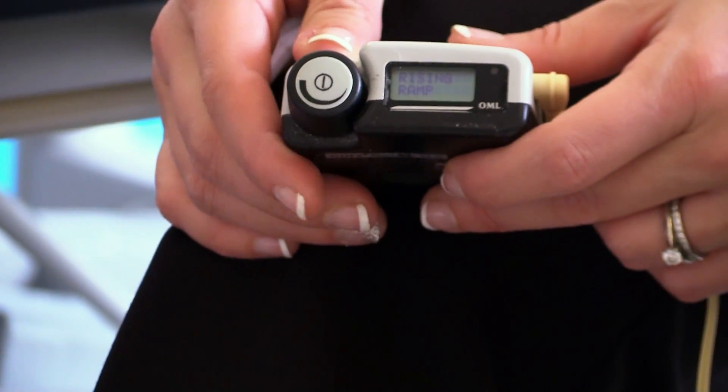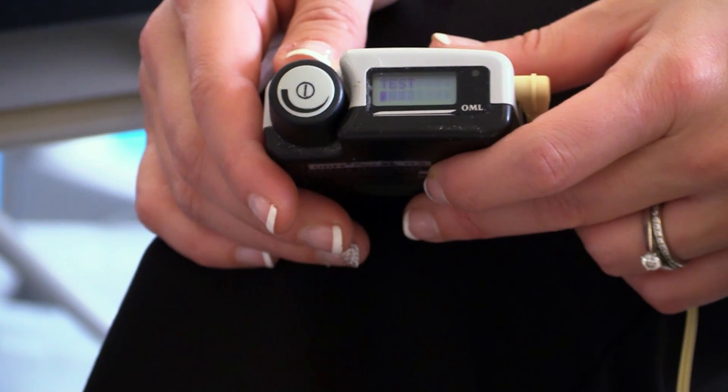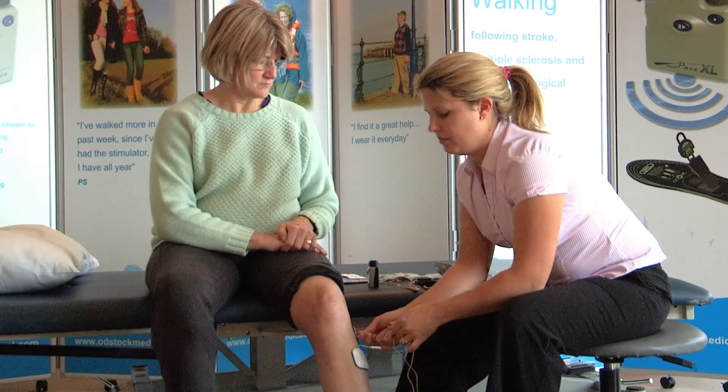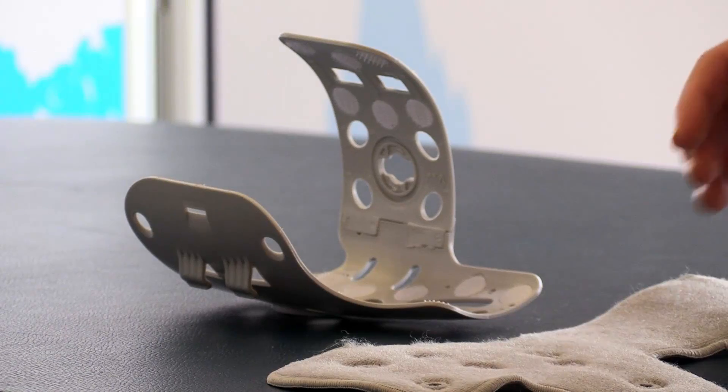Check the response to stimulation by pressing the test button. Then ask the patient to stand up and walk, checking that the settings are correct for all the timings. Once this is completed, ask them to sit down, then unplug the device and the electro lead. Now you're ready to set up the cuff.